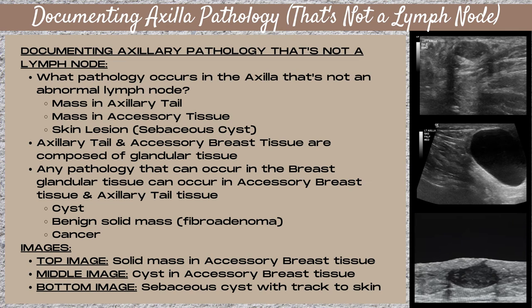The axillary tail and accessory breast tissue are composed of the same glandular tissue found within the breast, so any pathology that can occur in breast glandular tissue can occur there too — cysts, benign solid masses such as a fibroadenoma, and cancer. In the images shown, the top image is a solid mass within accessory breast tissue; the glandular tissue appears white just underneath the skin line, and that accessory tissue surrounds the mass.